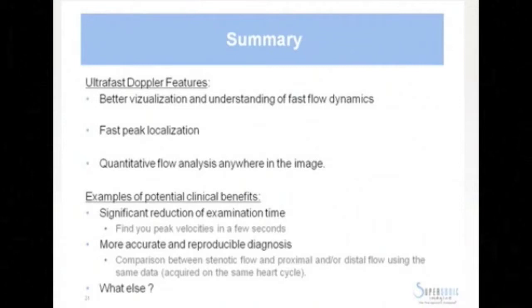Future of this mode. So today we are proposing it mainly for vascular application. So the workflow and the performance are optimized in this perspective. Tomorrow we will add new tools, for example, the automatic angle correction. Now you can choose your angle correction independently from one sample volume to the other, but you have to do it manually. So this is a first direction, adding new interesting tools to increase the efficiency of the workflow.